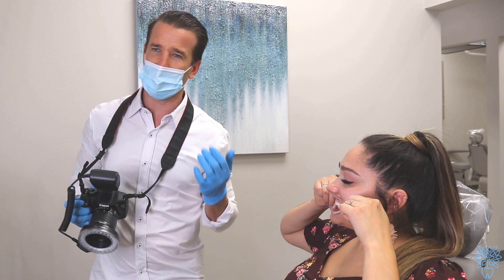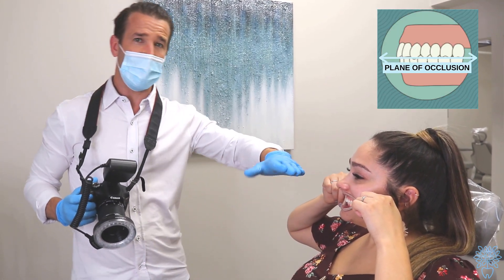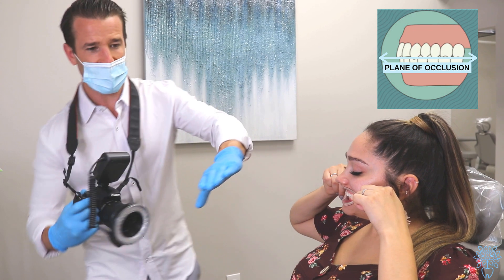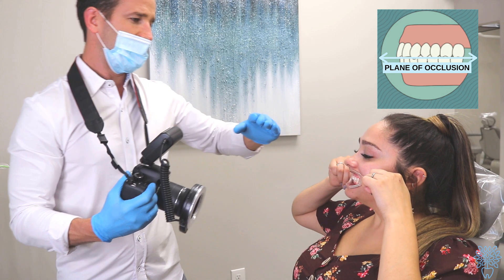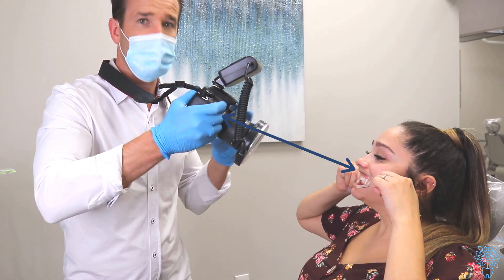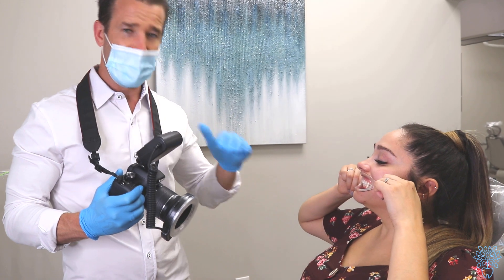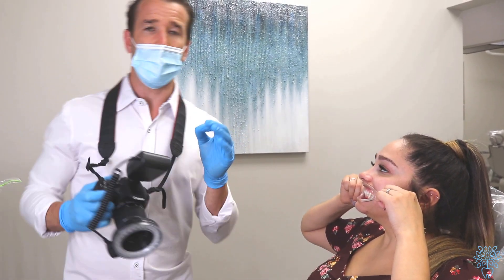The plane of occlusion is basically how the patient's head is tilted. If her head is tilted down, her plane of occlusion is down — you need to get the camera down too. If she tilts up, you need to be up, or move their face. You always want to be on the same plane of occlusion as the patient. That's how we take the front picture.